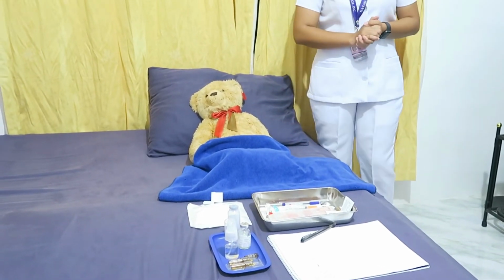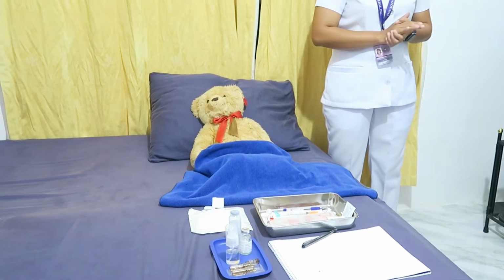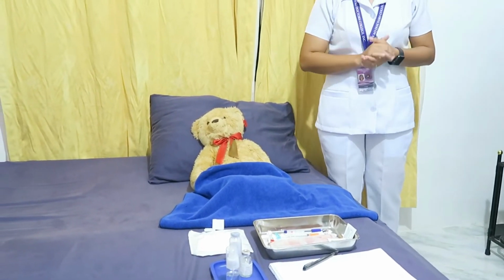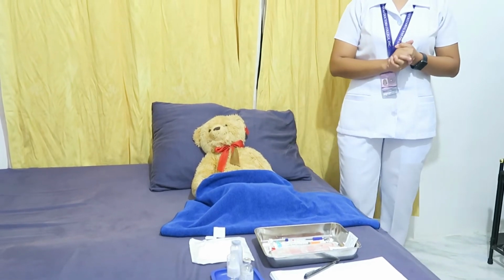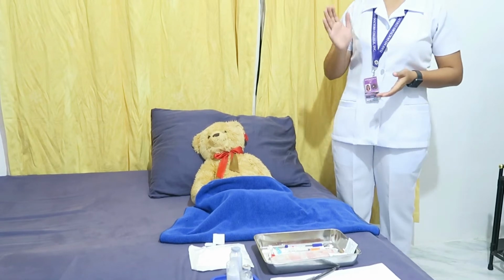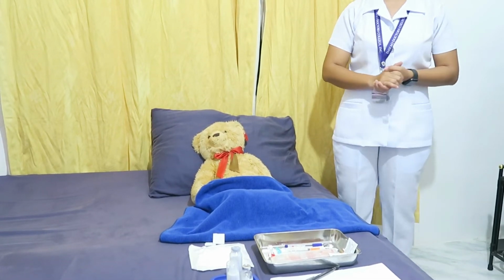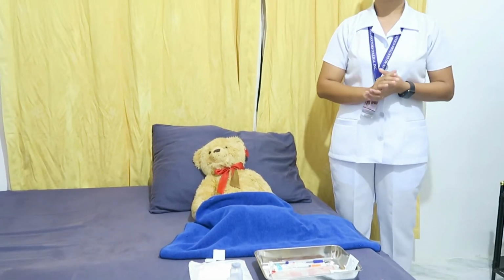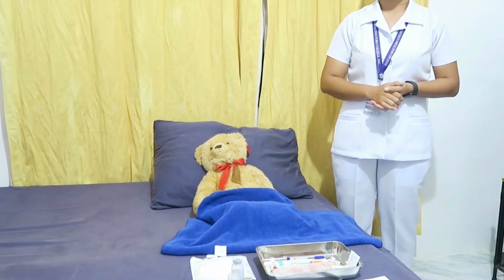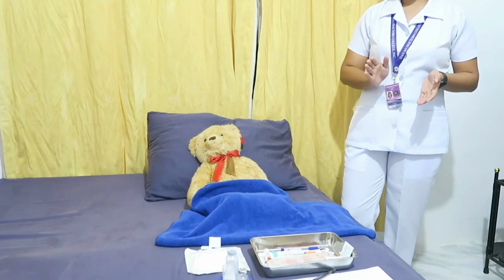Next is to assist the client to a position in which the arm or the leg, or the abdomen rather, can be relaxed, depending on the site that we need to use. The rationale for this is to have proper access to the site that is going to be used in the parenteral drug administration. After that is to obtain assistance in holding an uncooperative client.